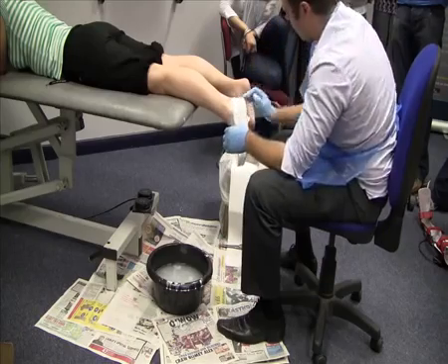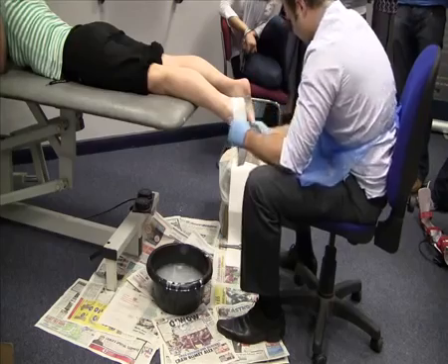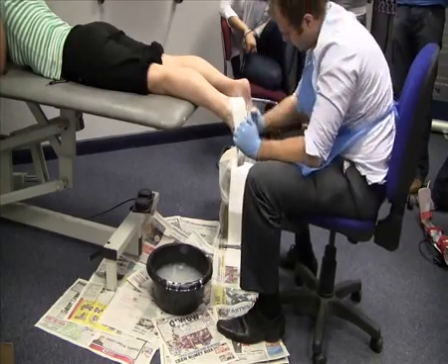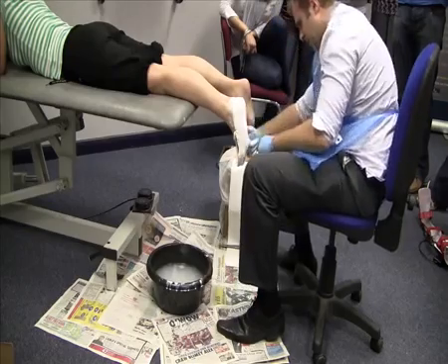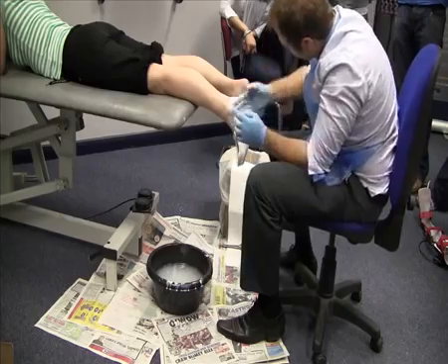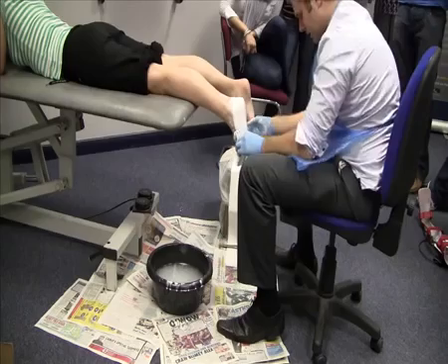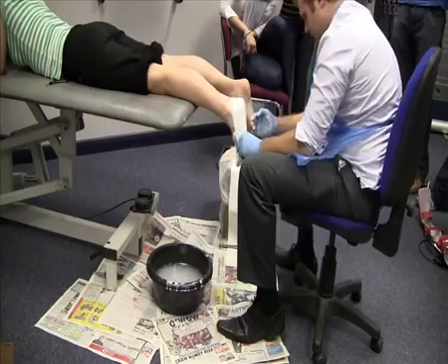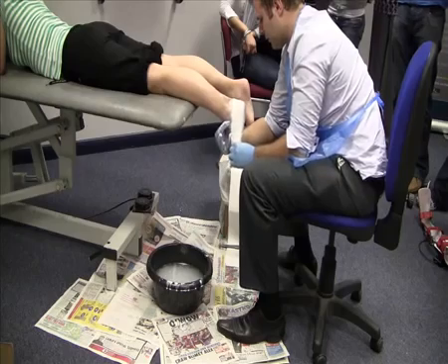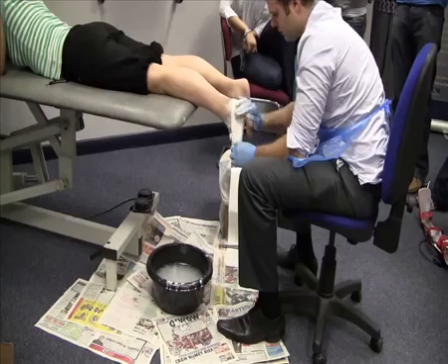You've got a bit more time to play around with this material. Wipe off any excess. Make sure that you've got a nice smooth cast. Sometimes you get an air bubble in the arch. Just make sure that's out. If you wipe off the excess, it will dry quicker. And then we're looking to 4th and 5th, come round, find neutral and hold.